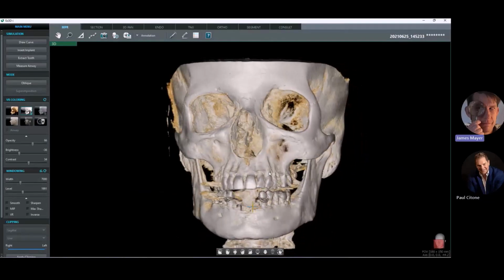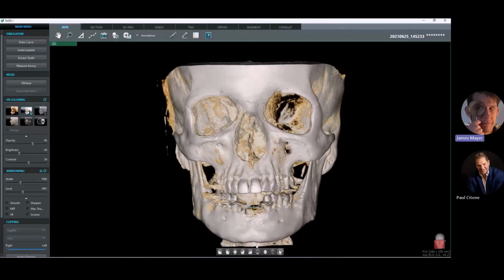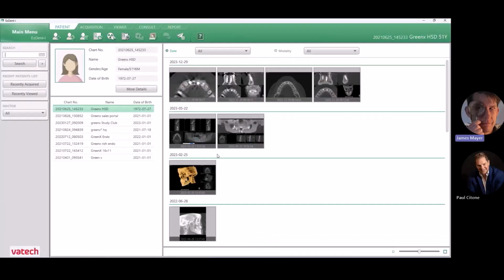And I think that about sums up what we wanted to talk about. We touched on looking at scatter. We talked about evaluating patient movement. And then we also talked about if we see any distortion in the images, redoing that beam alignment on the device. So I think that kind of concludes what we wanted to review on CBCT image evaluation.